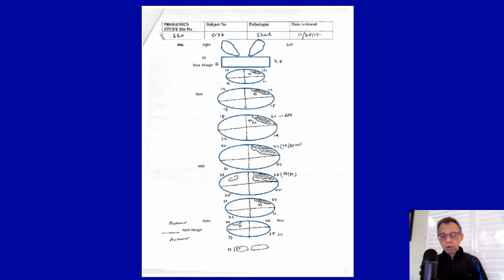A very important way is to systematically map out the tumor using this type of diagram. And this particular diagram will be especially helpful to you if you are doing a quadrant sectioning. If you are doing a whole mount sectioning, it is somewhat easier to determine which one is your index tumor. So in this particular example, you can see that there is a dominant tumor nodule which involves the left posterolateral aspect of the prostate from mid all the way to base as well as apex.